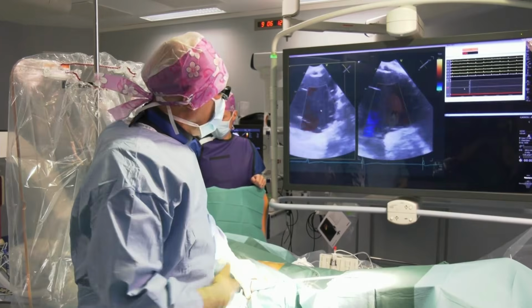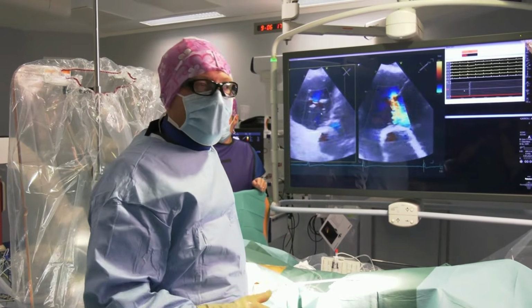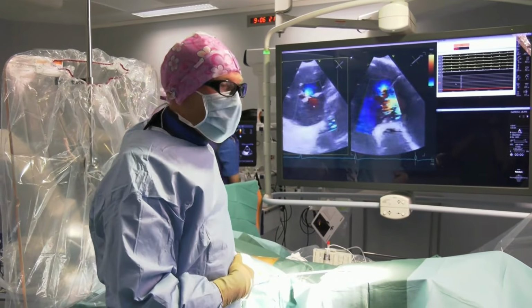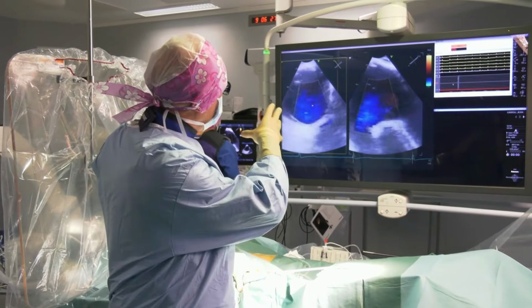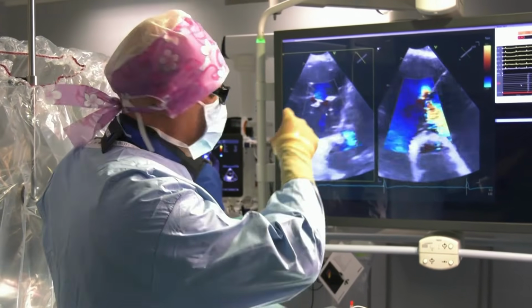So for this procedure, we start with a classical echo-guided venous femoral puncture with pre-closing with a ProGlide. And now if we have a look at the echo images, we can see here in the transgastric view, we can clearly see that it's a tricuspid valve.